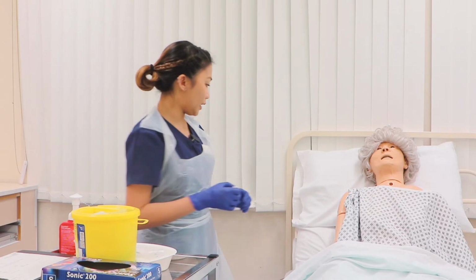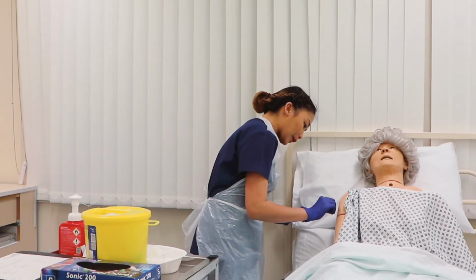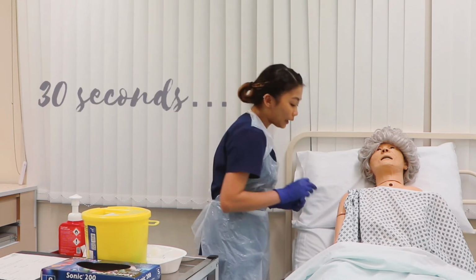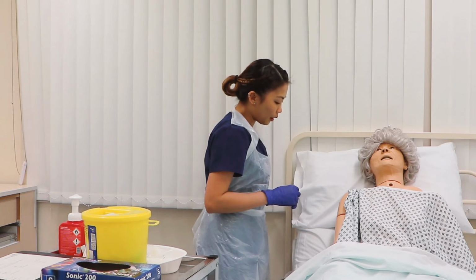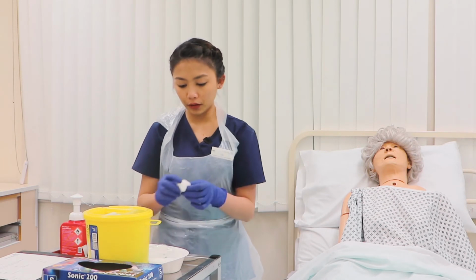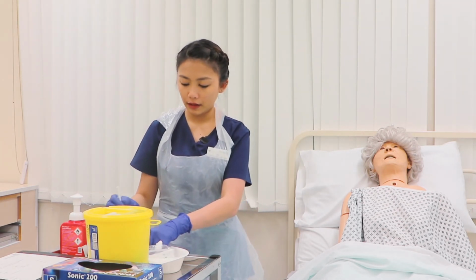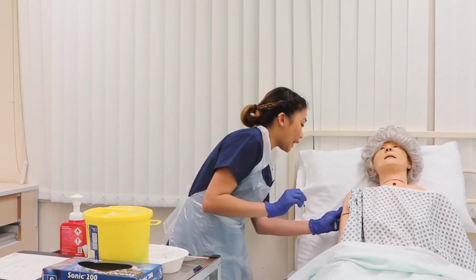I'm going to clean the injection site, cleaning it from inner to outer for 30 seconds. Cold wipes coming. 1, 2, 3, 4, 5, and allowing it to dry for the next 30 seconds. I'm going to get the cotton balls and place them in between my fingers in my non-dominant hand. Okay, Andrea, I'm going to pinch your skin.